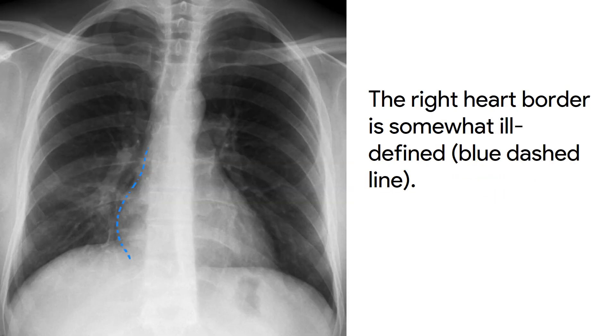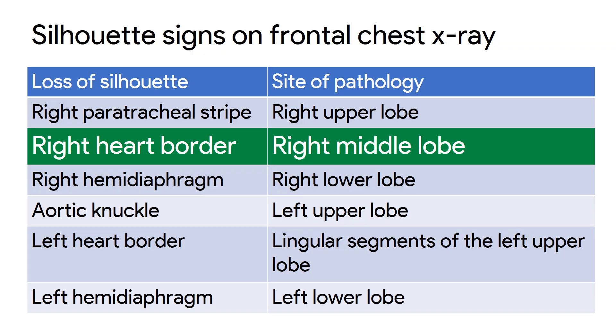The right heart border is somewhat ill-defined, shown by the blue dashed line. The silhouette sign states that if the right heart border is obliterated, the pathology is in the right middle lobe.